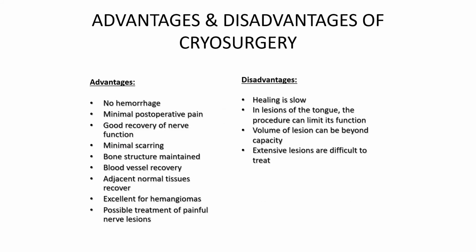Advantages and disadvantages of cryosurgery. Advantages: no hemorrhage, minimal post-operative pain, good recovery of nerve function, minimal scarring, bone structure maintained, blood vessel recovery, adjacent normal tissue recover, excellent for hemangiomas, possible treatment of painful nerve lesions.